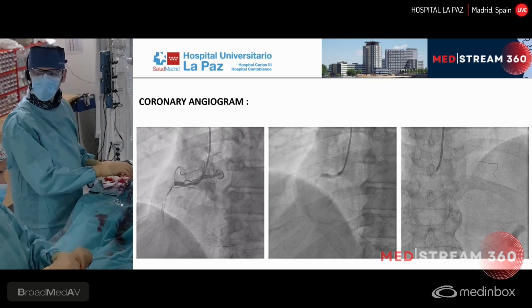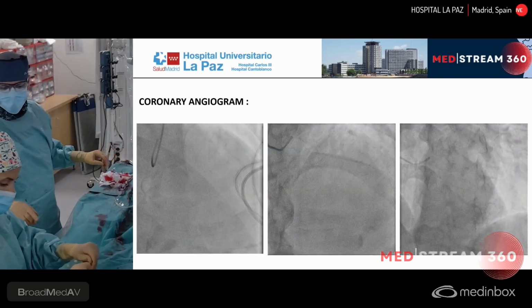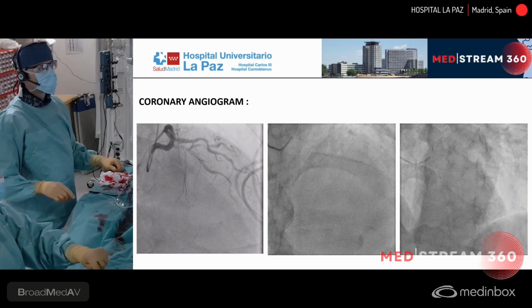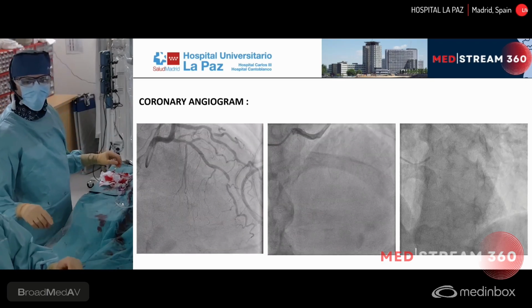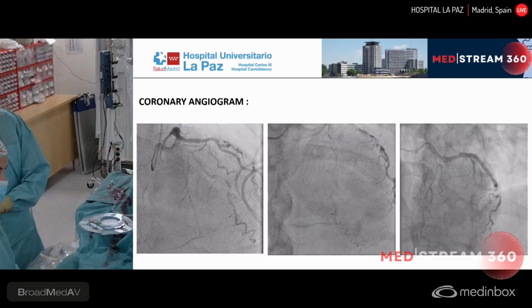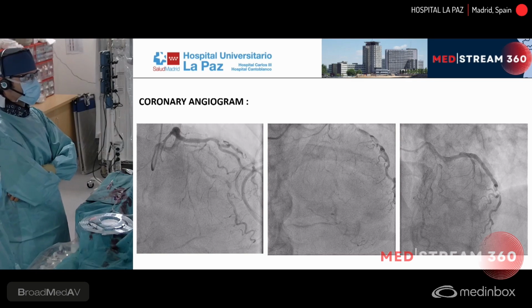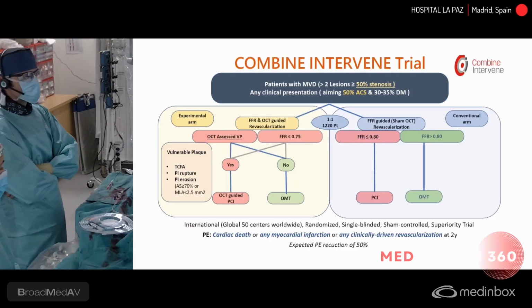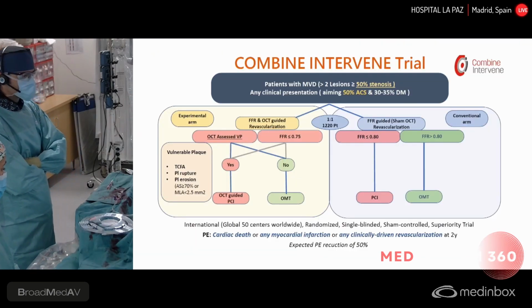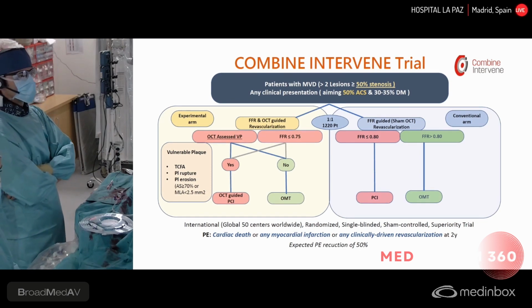This is the image of the right coronary artery. Here is the pressure wire, okay? And this is the LAD. The plan for today is to perform angioplasty guided by pressure wire and OCT in the anterior descending artery if necessary, and to conduct an intracoronary imaging examination of the stent in the right coronary artery.